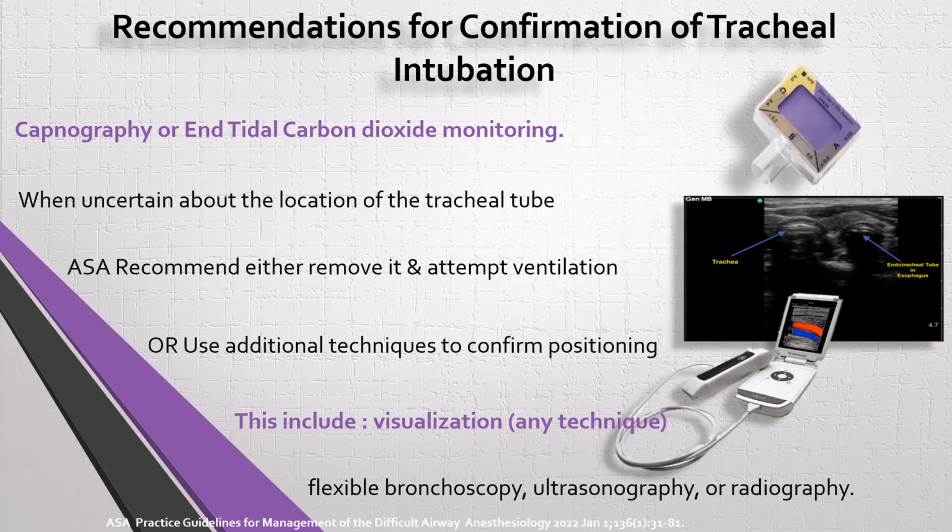And as in the picture here, on ultrasound, you can see the endotracheal tube in the esophagus and the other circle is the trachea. So this is esophageal intubation, not endotracheal intubation.